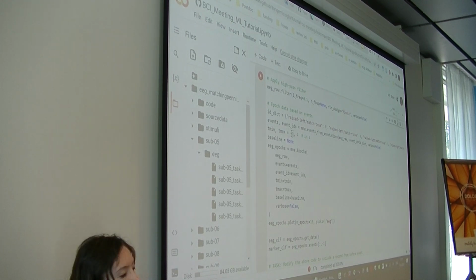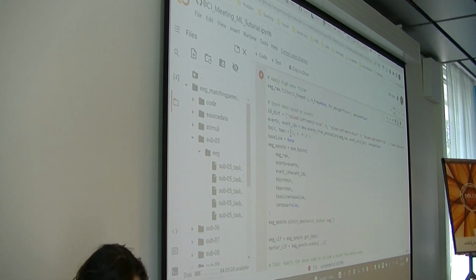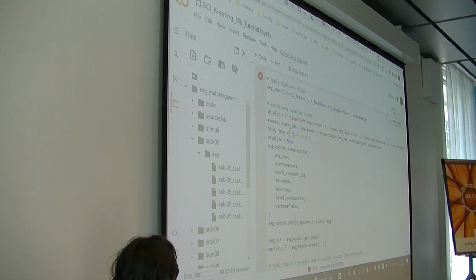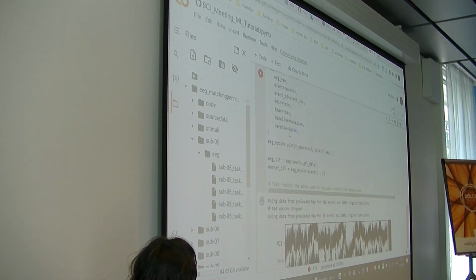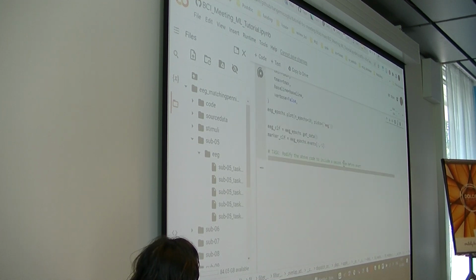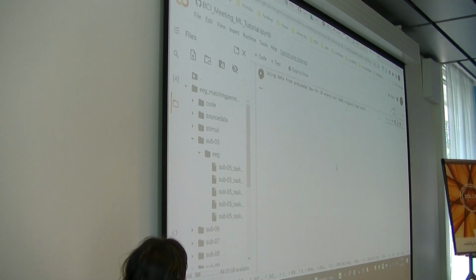All right, moving back to us for a bit. The solution to this one is pretty quick. You just need to change tmin to -1 and delete the error here. After that, you should have the tmin starting from a second before the event. And since we are moving on to some of the actual ML part after this, we also want to cover some theory after this loads.